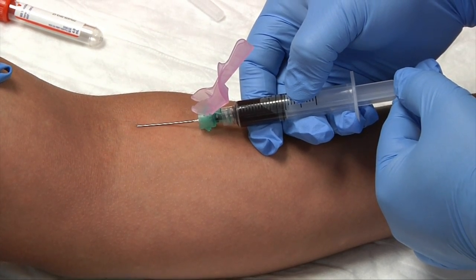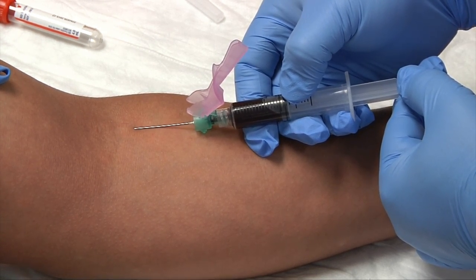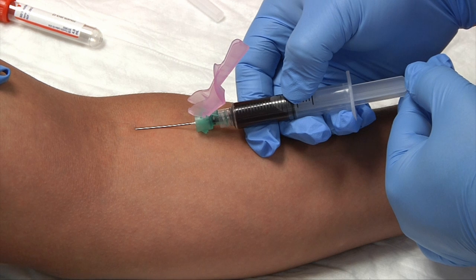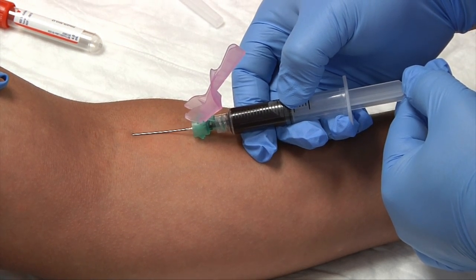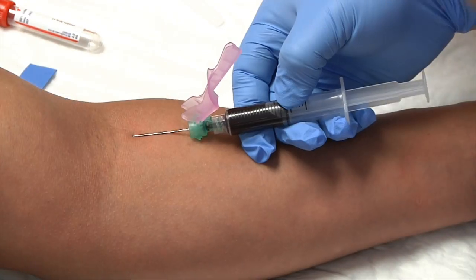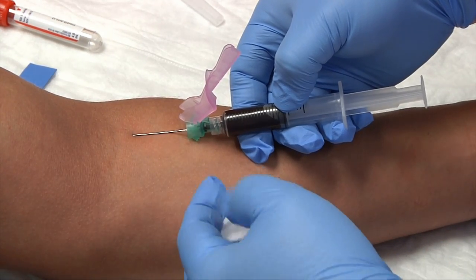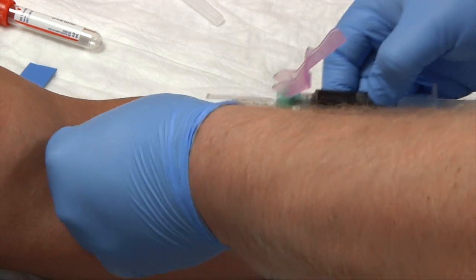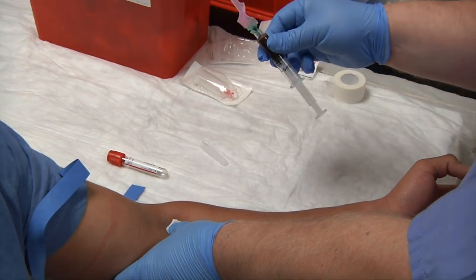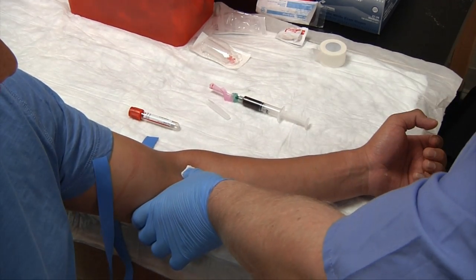As you're drawing, keep in mind your patient may be nervous — it's okay to talk to them, it will put them at ease. This can take a couple of minutes. Once you have your three milliliters, release your tourniquet, grab your gauze, fold it over once then twice, pull the needle out, apply pressure, and immediately safety cap the needle. In this instance only, you can set the syringe down on a disposable chuck and finish bandaging your patient.